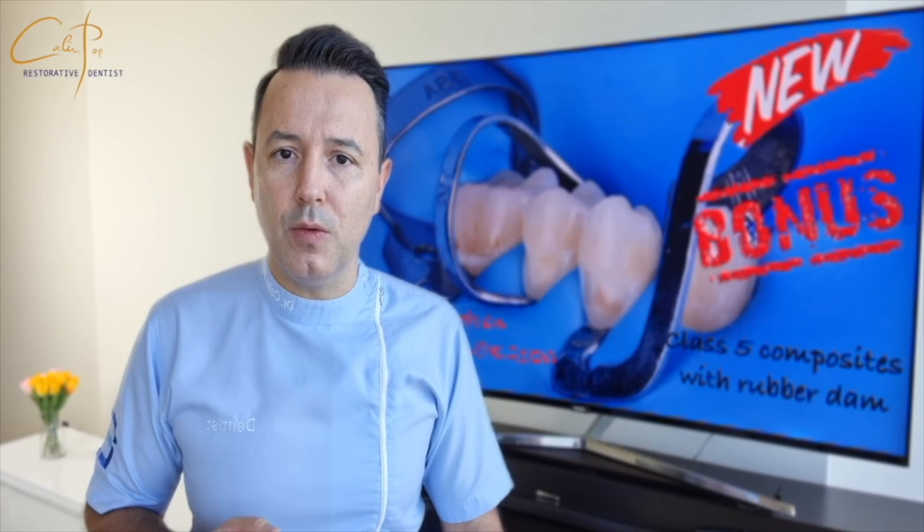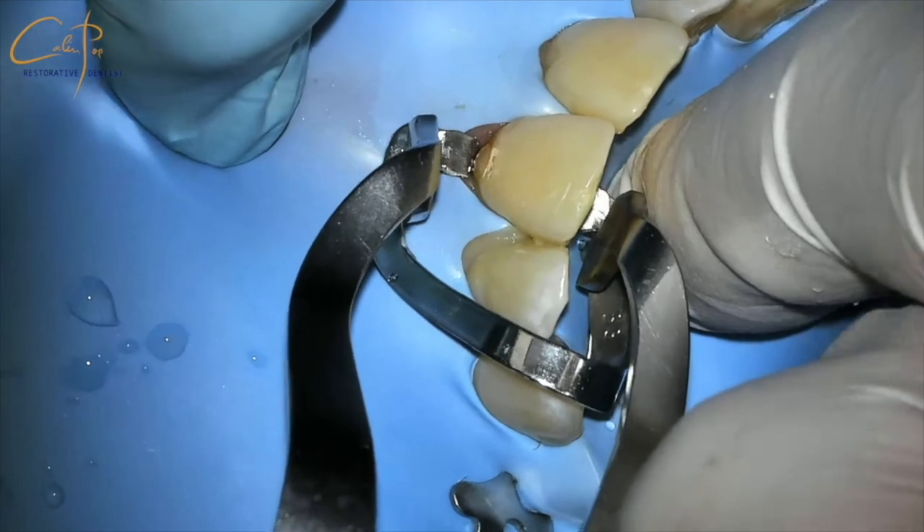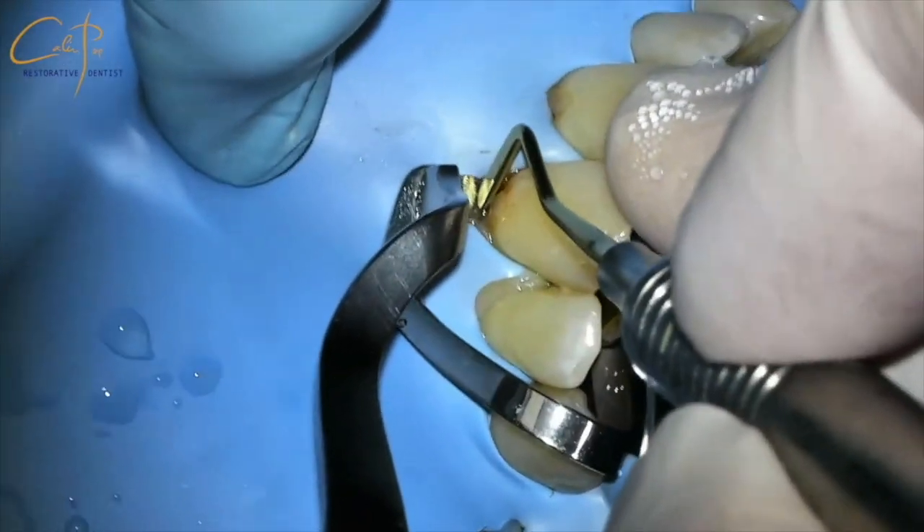I am filming this video with a camera mounted on my loupes to be able to show the action from the dentist's perspective, because this is the angle that every one of us relates to better.